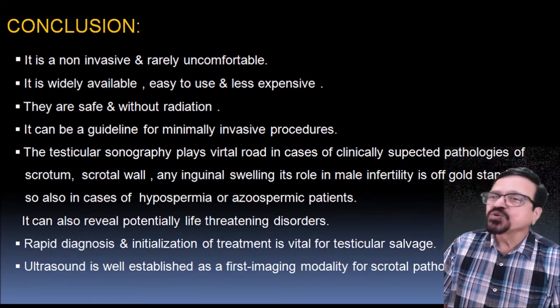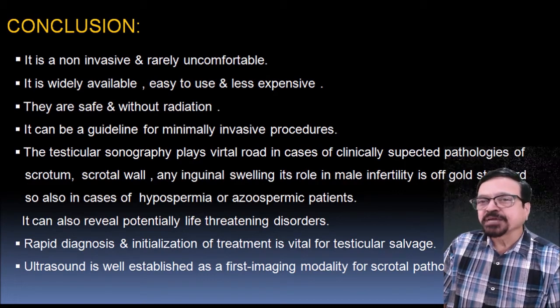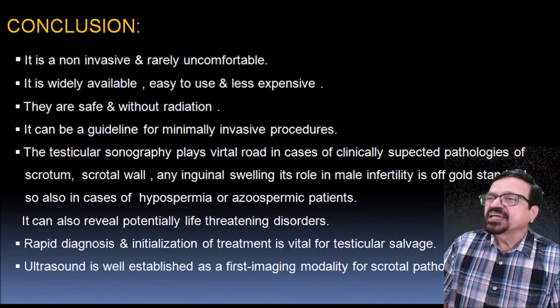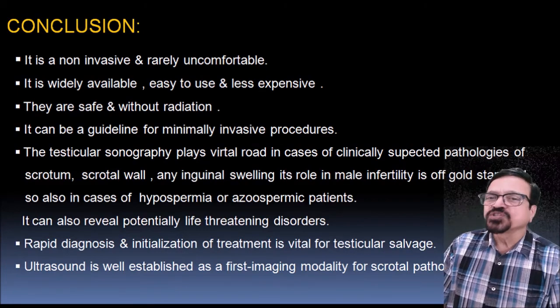Testicular sonography plays a vital role in cases of clinically suspected pathology of the scrotum, scrotal wall, or any inguinal swelling, and also in male infertility, where it is the gold standard.